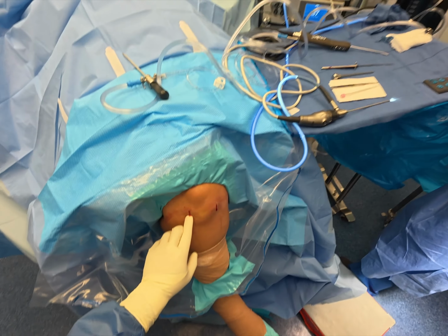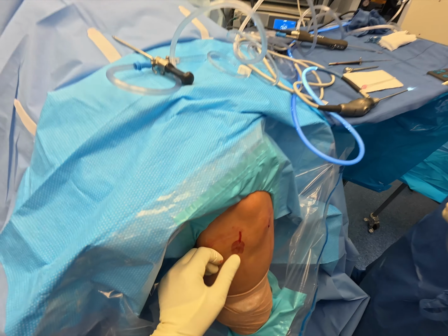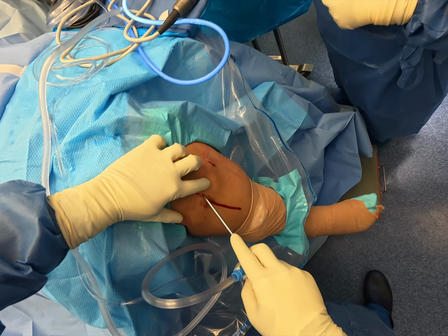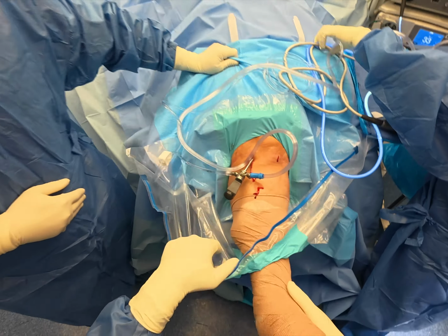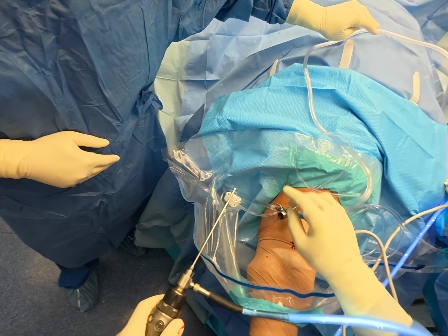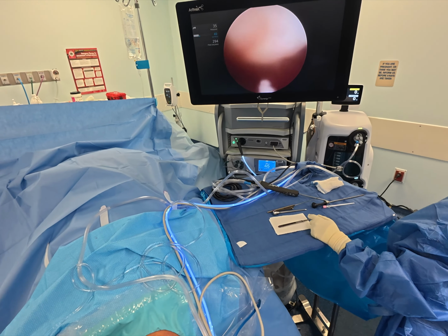All right, 11 blade. Here we go again, making that incision next to the patella tendon at the level of the joint line, starting. Careful, careful. Excuse me, Joey. Going into the joint. There we go. Underneath the kneecap. Getting rid of the effusion, the water in the knee. Flushing it out. And going in with the scope. So here I am looking underneath the kneecap.